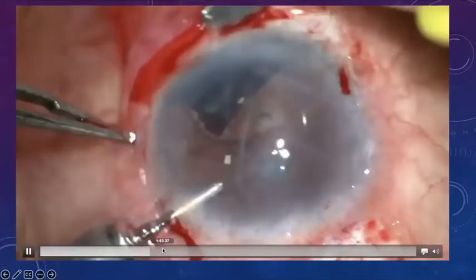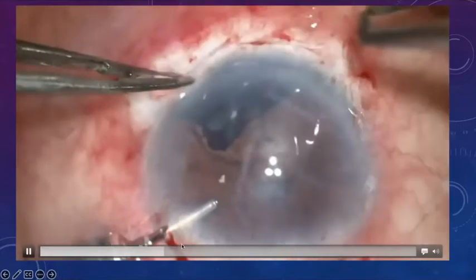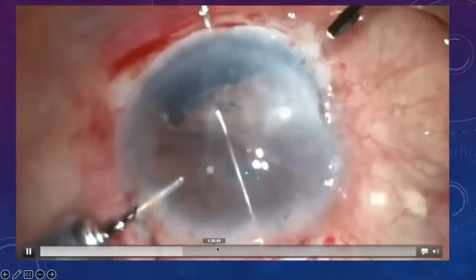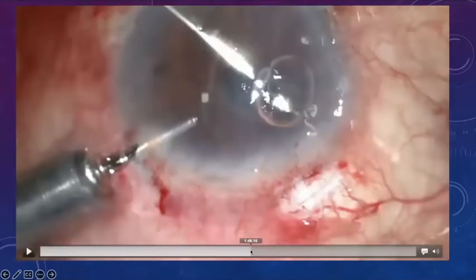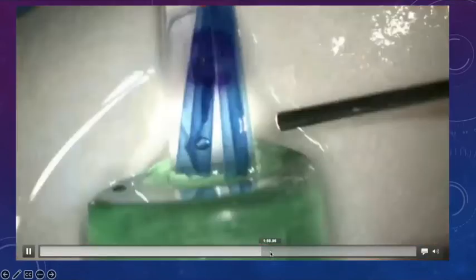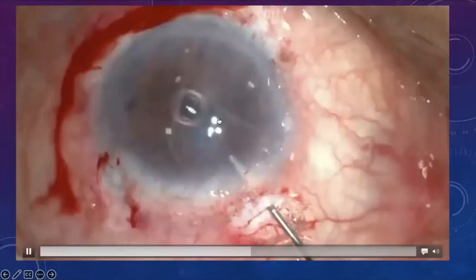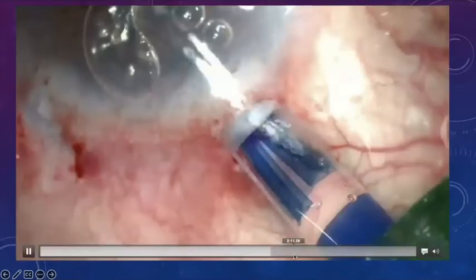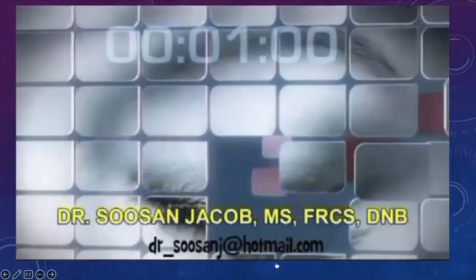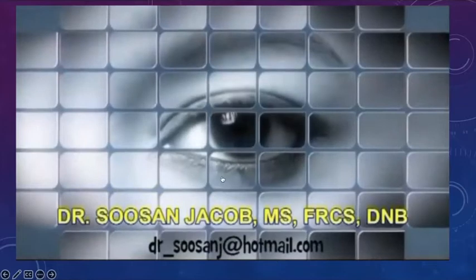So what I do here is, again, an iridodialysis repair by making a groove and then attaching the iris back using a double arm suture. And we've got the entire iris back there. We've got a round pupil. So that's looking pretty good. And then we go ahead and inject the PDEK graft and do an air pump assisted PDEK as well as an EPDEK.